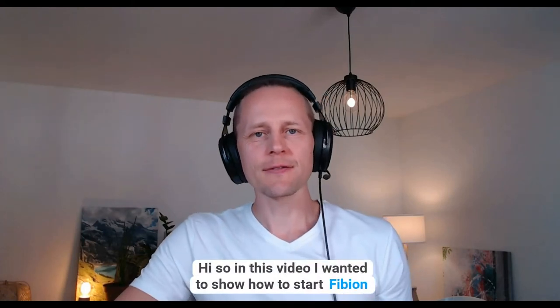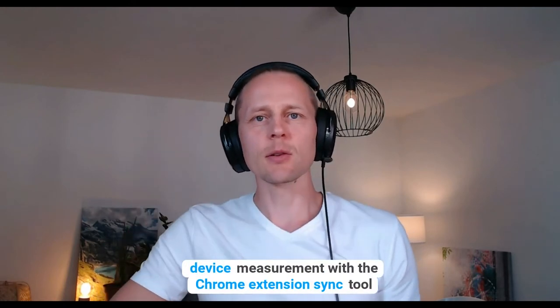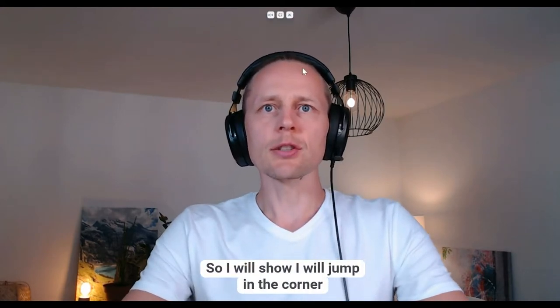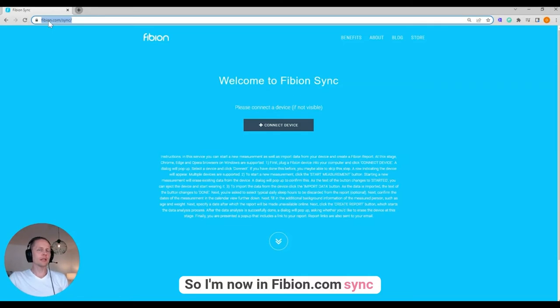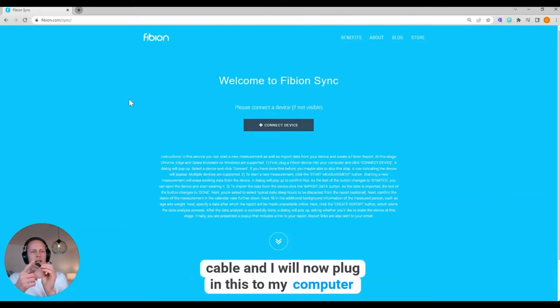In this video I wanted to show how to start a Fibion device measurement with the Chrome extension sync tool. I'll show my screen — I'm now at fibion.com/sync and I have connected the device with the USB cable.